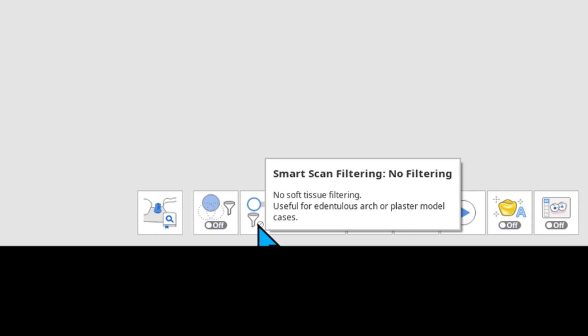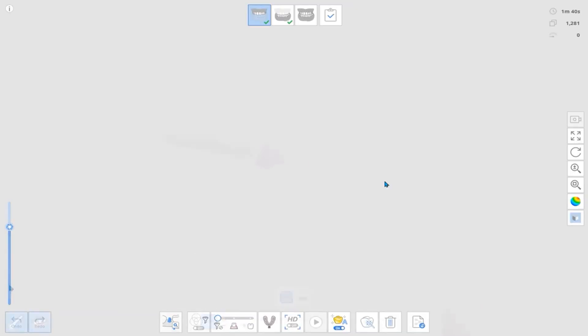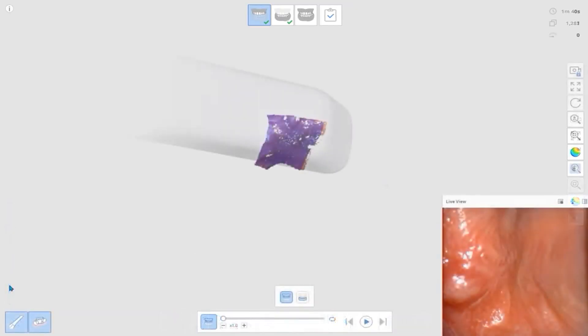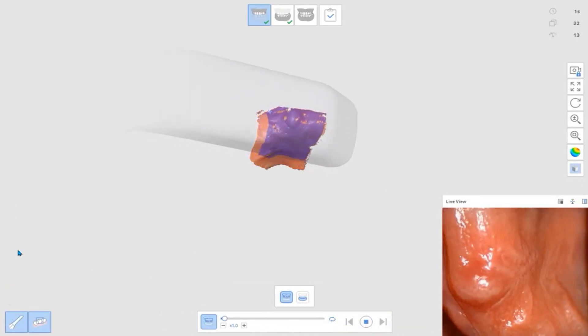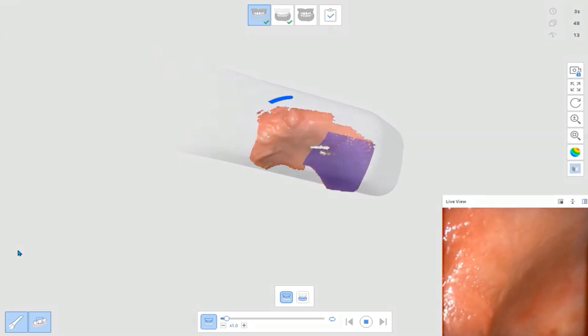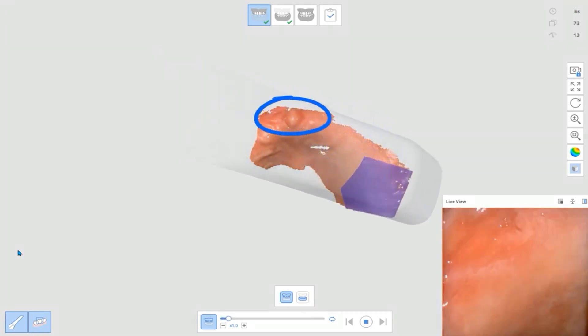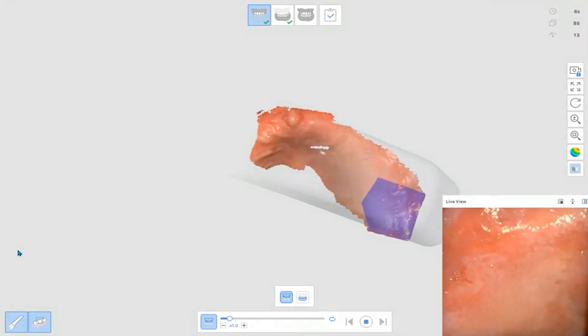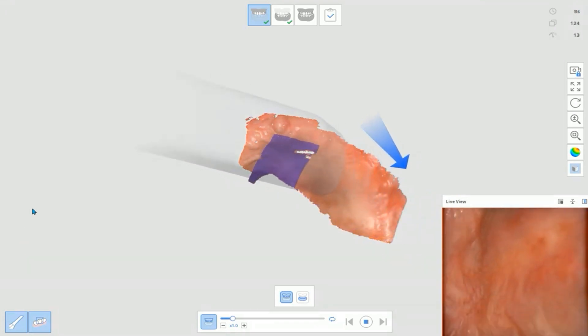Let's go ahead and begin with the Edentulus Maxilla. Your starting point will be the Ruge area. Scan the Ruge area and build up the primary data by taking the alveolar ridge on both left and right.